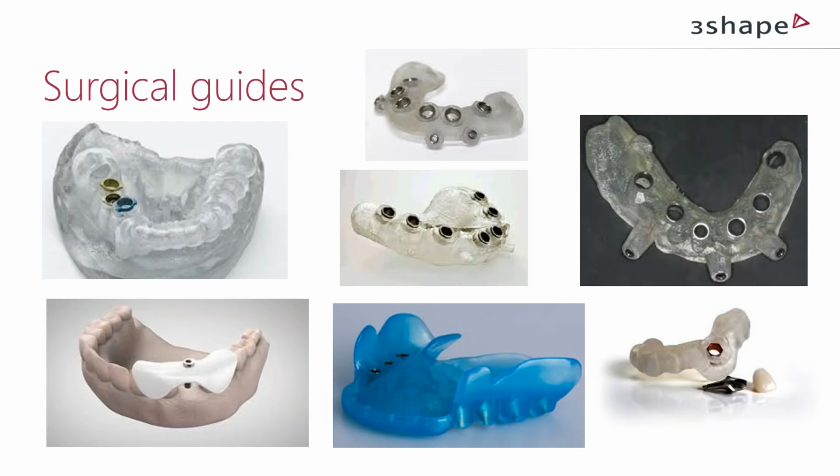Surgical guides, they come in many shapes and sizes. This is just a few that I found on the net, but everything that is the same for them is that they give support for the drill, not having the doctor or the surgeon to be able to wiggle on the hand or have an unsteady hand when doing the surgery. And some of them actually also gives the direction and the depth of the drilling. So it depends on which kind of guide you are using.